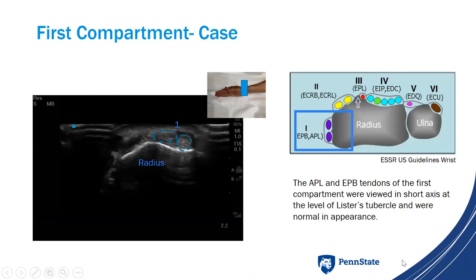For our case, we used a different transducer so image quality is not as high, but you can still identify the first compartment tendons in short axis — they look pretty normal with that broomstick appearance you expect. In my report I would say: 'The abductor pollicis longus and extensor pollicis brevis tendons of the first compartment were viewed in short axis at the level of Lister's tubercle and were normal in appearance.'